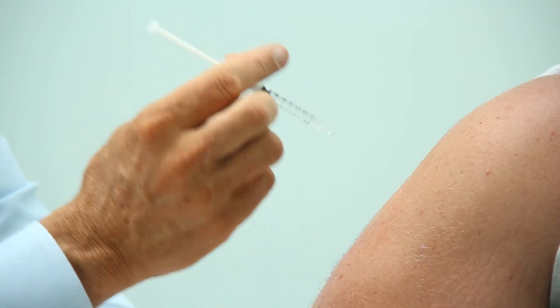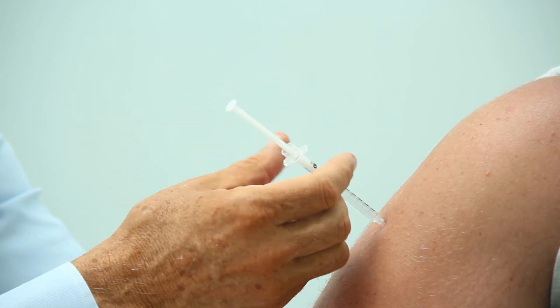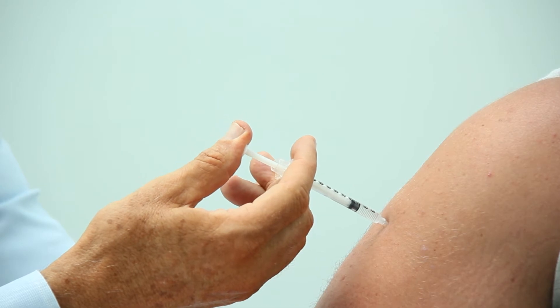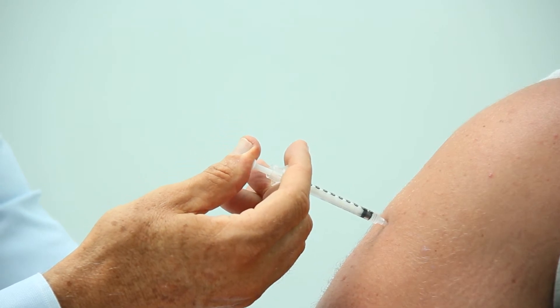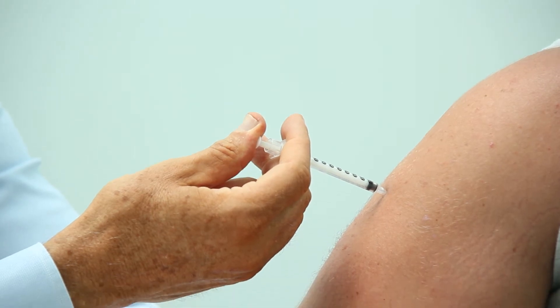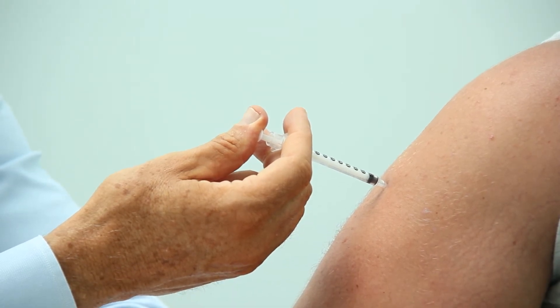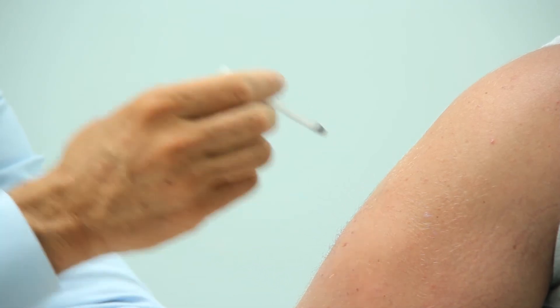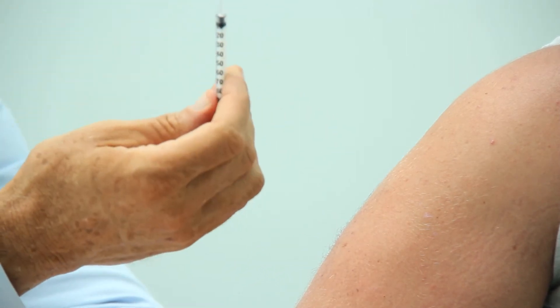Then just like a dart, right underneath the skin, push the plunger down and inject your medication. Usually I like to count five, four, three, two, one after an injection, just so all the medication is absorbed. Then pull the needle out and that's it.